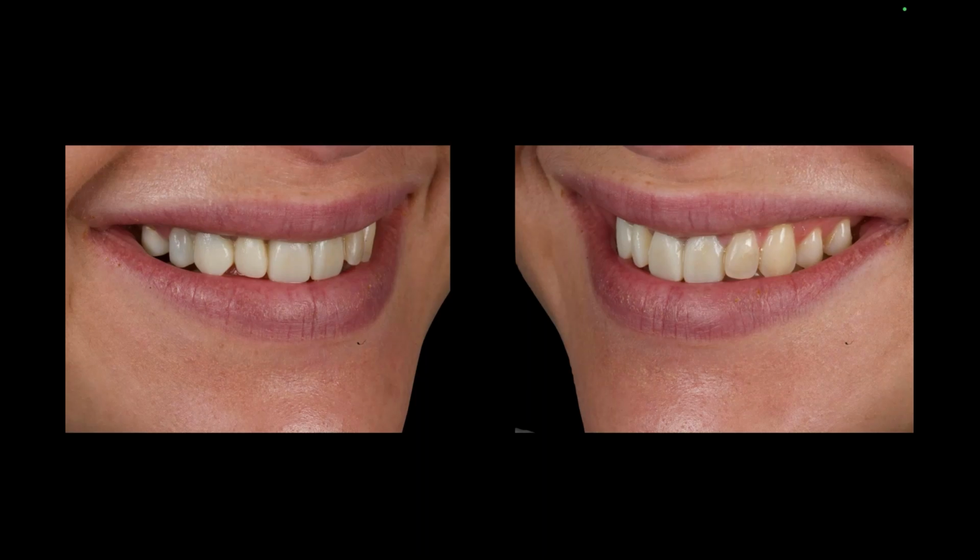And if you're layering, you have very small amounts of room to layer in. So that's really just about powder. It's really about choosing which powders to work in at the best moment. It's very difficult to create fluorescence in very thin areas, because then you have too much fluorescence close to the surface.